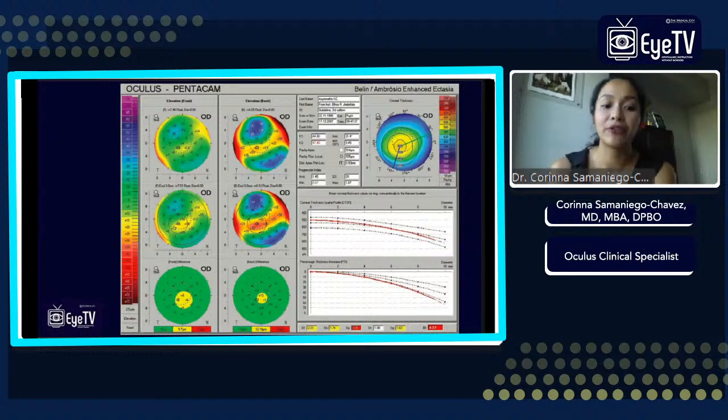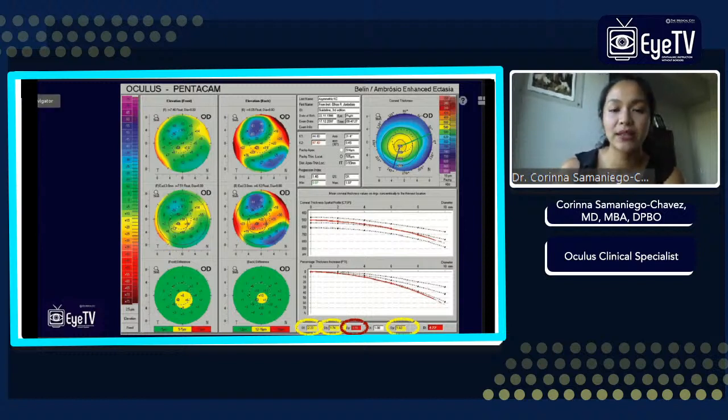This is an example of a case that was diagnosed as mild keratoconus based on the anterior cornea only. Upon analysis with the enhanced ectasia display, there are also changes on the posterior surface, more dramatic changes in the pachymetric progression, which is red at 3.70 standard deviations from the mean, and a mild displacement of the thinnest point. The combination of these, however, is well outside the normal range with a final D clearly in the red zone.